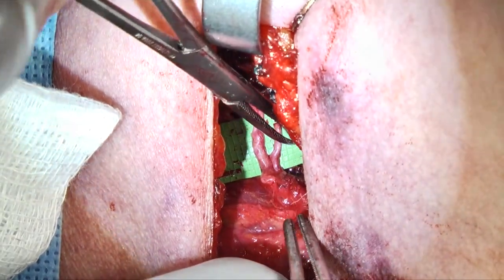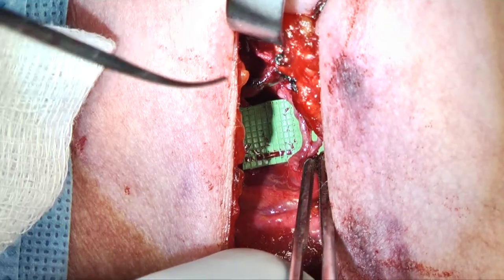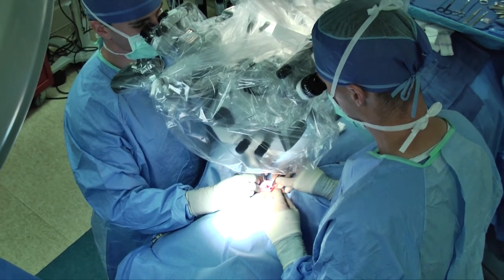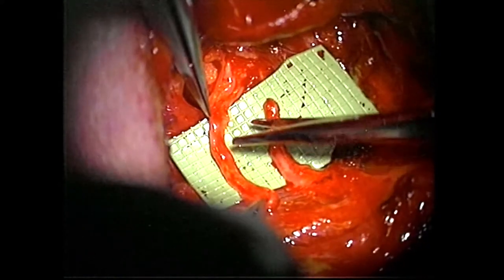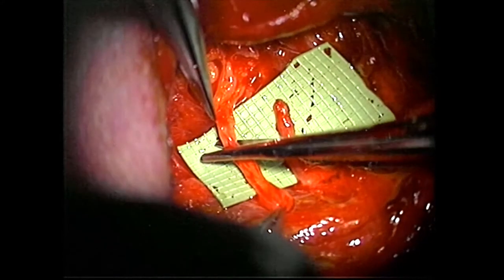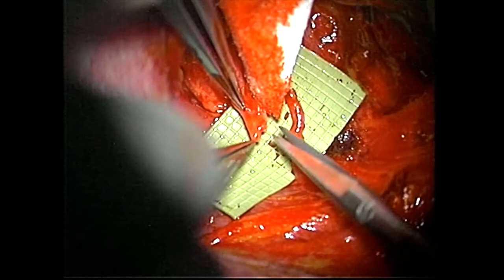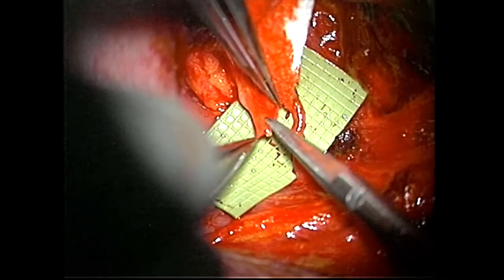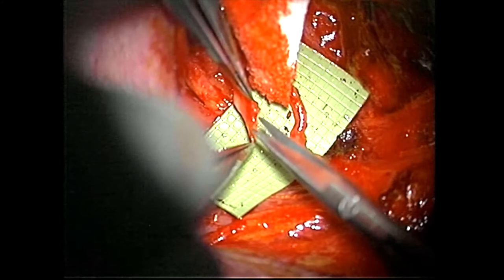Now we place the green background in place. I typically use a microscope to suture these together, though some people just use their loops. With these nerve re-innervations, as long as you get the nerves close they will re-approximate nicely and grow together quite well. Here we're cutting a bit of that recurrent nerve to make it shorter so it will re-innervate a bit faster and you'll have better bulk of the true vocal fold. This does not allow for movement of the true vocal fold, but just good bulk. Sometimes you clear off a little bit of the fascia if there's some excess, but you definitely don't have to clear all the fascia off.